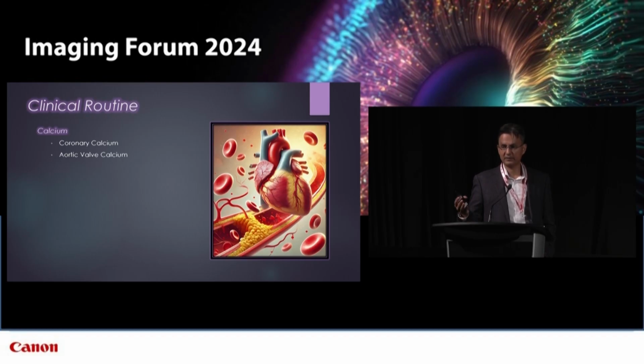We've heard a lot about the HR challenges, both from the technologist and the radiologist side. We're a regional cardiac referral center, and these currently largely come to us, but this is a non-contrast study. There's gated CT in every community hospital now. There's no reason these can't be done out there. And as that HR shortage starts to manifest itself more and more, the need for community partners to really do this will be more and more important.